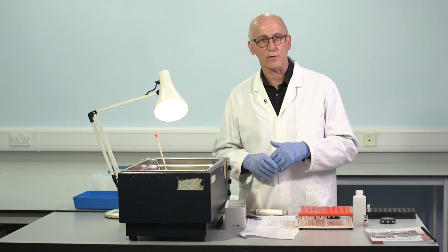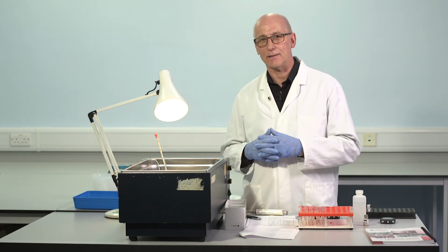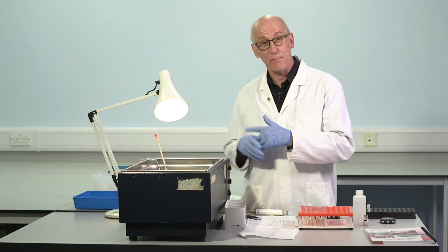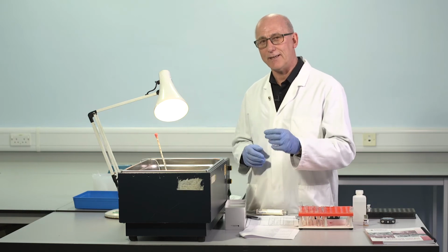Something is wrong with one of those clotting times, and we'll know which when we come to the graph paper to make the calculation. Something's gone wrong somewhere in one of those tubes. And it's sort of known for that to happen when we're running a test manually in this way. It's another reason why we make a calibration curve at the beginning and at the end.